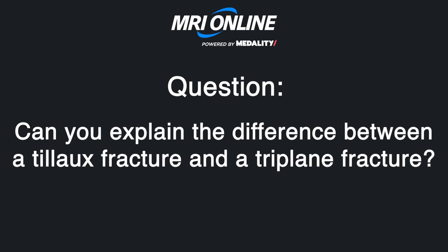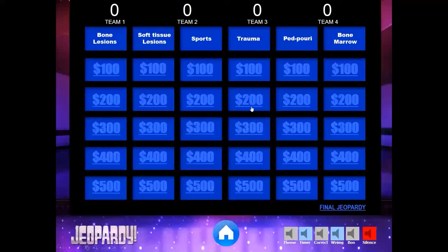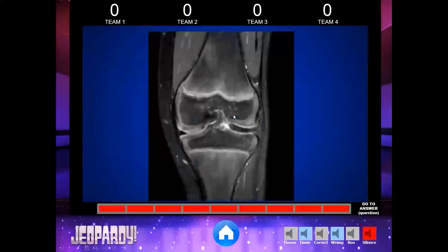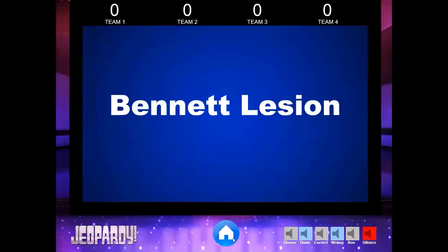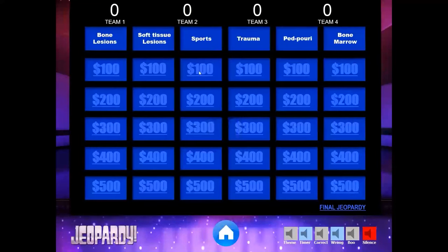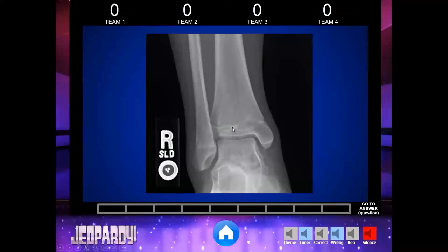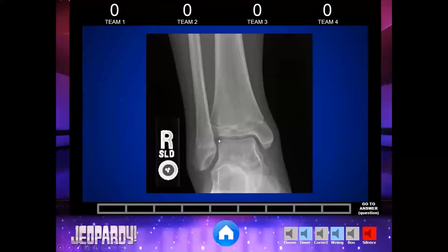Regarding Tillaux fracture versus triplane: the Tillaux fracture — the best way to think of it is as an avulsion fracture, specifically an avulsion of the syndesmotic ligament pulling off the anterolateral corner of the tibial epiphysis, producing a Salter-Harris 3 fracture. A triplane fracture is not an avulsion — it's a different fracture altogether. You have a fracture in three different planes: a vertical fracture through the epiphysis, going through the physis, and on the lateral view the metaphyseal fracture. So it's three parts — Salter-Harris 4.